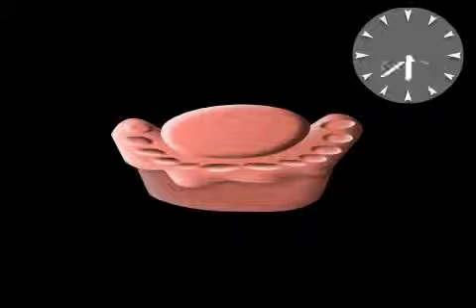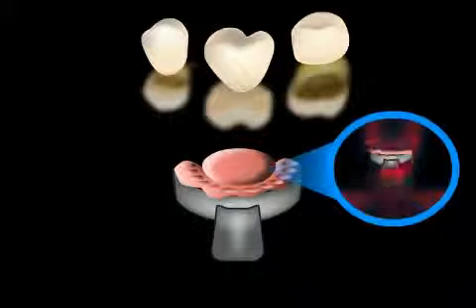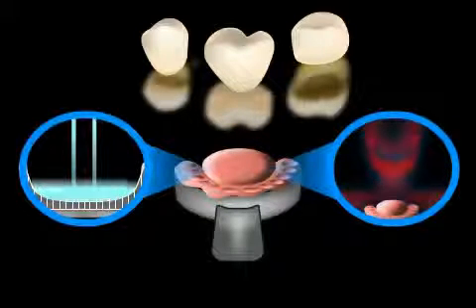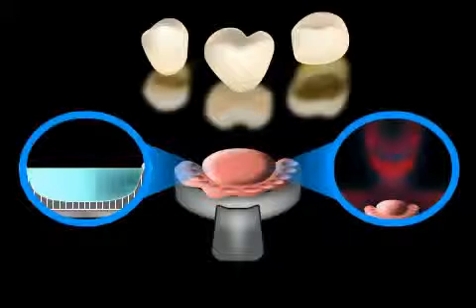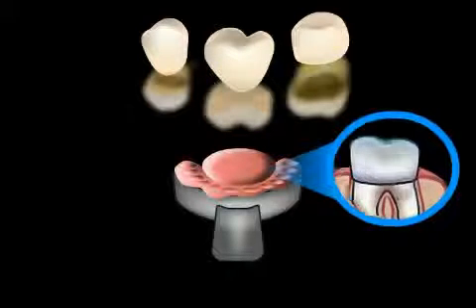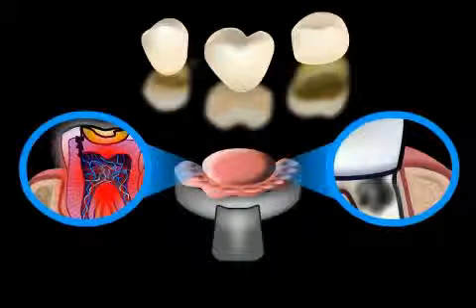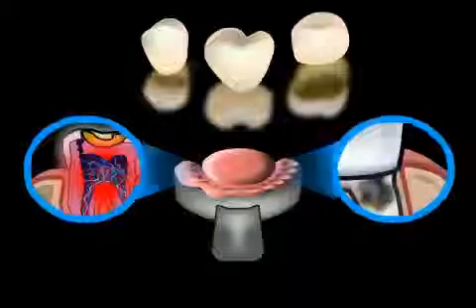In most cases, dental materials are subject to volume changes during hardening, and because of this, are particularly sensitive to faults. Ill-fitting technical work, such as crowns, can sometimes be traced back to non-compliance with setting times, among other factors. If the impression material is taken out of the patient's mouth too early, or if the dental technician pours the plaster for impression too late, volume faults may result, and this can lead to leaking crowns in the patient's mouth. Negative consequences such as secondary caries and/or bleeding or receding gums are the result.